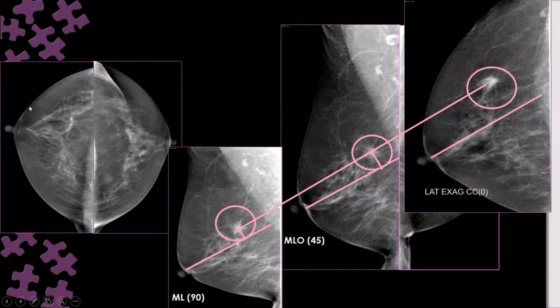The nipple is tilted medially. If I divide the breast, the lateral aspect is smaller than the medial, so most likely this lesion will be lateral. Being just in the upper or posterior portion, the probability of being lateral is more than medial, unlike the previous cases we discussed.